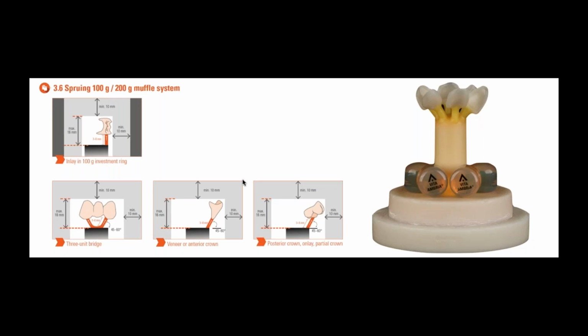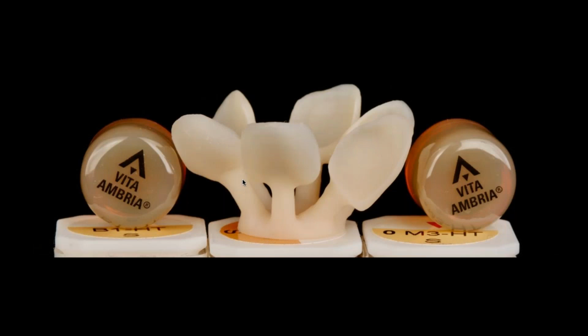Today I don't want to go too much on the lab side of this. We're talking more about the integration between the clinician and the technician, and the discussion of how to select the material and why we select the material. As I said here, I like to use the T, not the HT, because the shade is not ideal where we're starting, and this is a very nice and clean result after pressing.